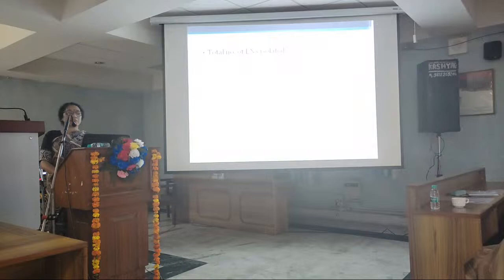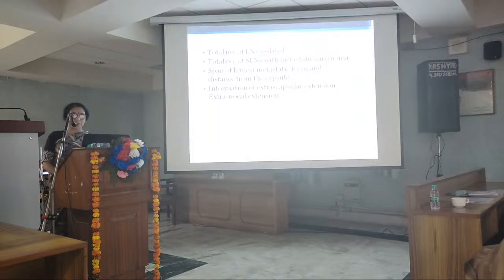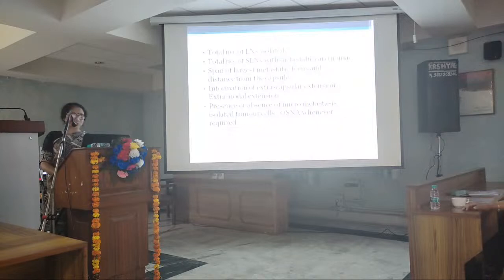So what the surgeon expects from us is the total number of lymph nodes which we have examined, and how many of these sentinel lymph nodes have metastatic carcinoma, what is the span of the largest metastatic focus, whether it is macro or micro, what is the distance of this metastatic nodule from the capsule, whether there is some extracapsular or extranodal extension, or whether isolated tumor cells are present. This is really difficult to do on frozen section.